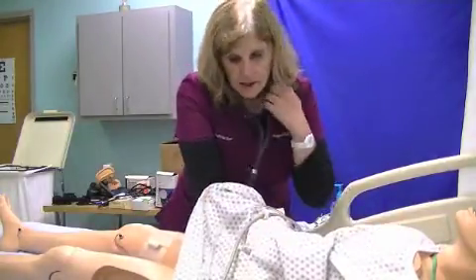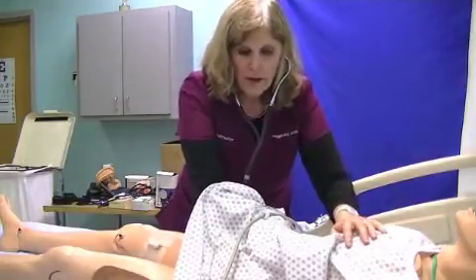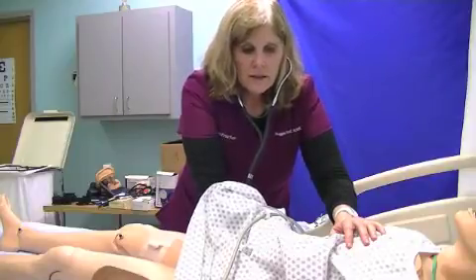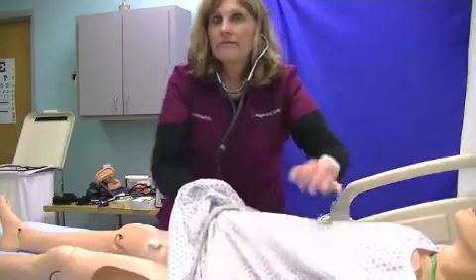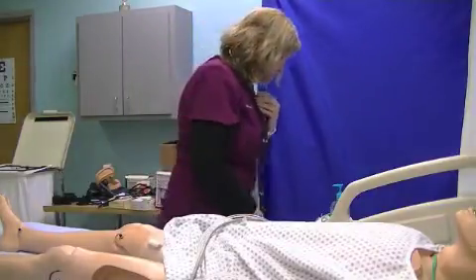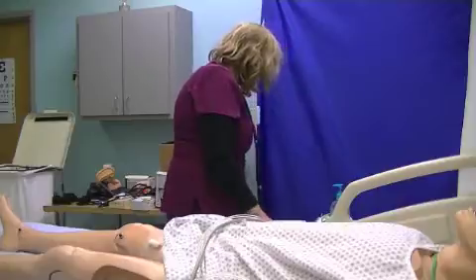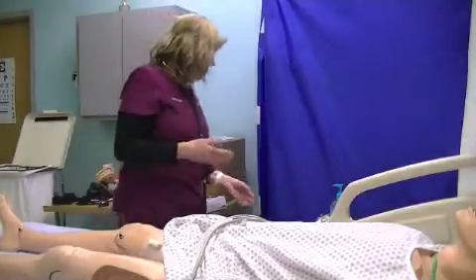You're going to have these in your ears, and you're going to listen to what we call lub dub. Each beat, 1, 2, 3, 4. We're going to listen to the apical pulse for a full 60 seconds. If it's below 60 and we have digoxin ordered, we're going to make sure that we hold the medication.